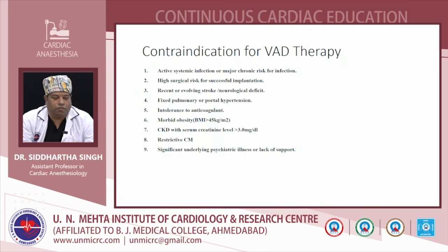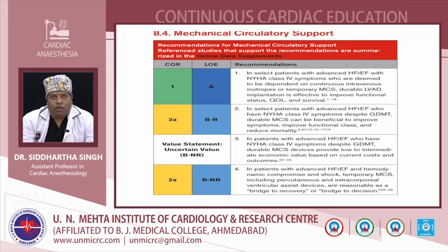The contraindications to VAD therapy are any active systemic infection, major chronic risk for infection, high surgical risk for successful implantation, recent and evolving stroke and neurological deficit, fixed pulmonary or portal hypertension, intolerance to anticoagulants, morbidly obese patients, CKD with serum creatinine more than 3 mg per deciliter, restrictive cardiomyopathy, significant underlying psychiatric illness or lack of any support. Mostly the FDA has approved mechanical circulatory support.